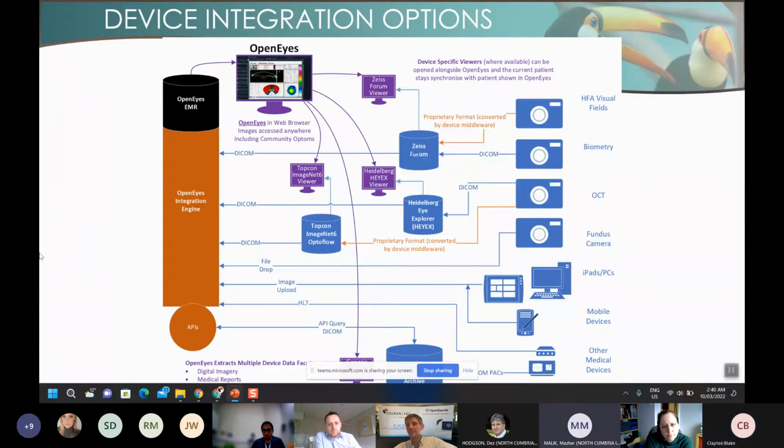Right. And of course, when you send out forms and letters and information, there's data that's sent via those sorts of systems, and we've done some similar interfaces where they interface into those. But there's not that tight bidirectional coupling, because although technically it's simple, there are a few logistical issues with it. But it's certainly on the roadmap. Right. Thanks, Maz. Anybody else got anything?